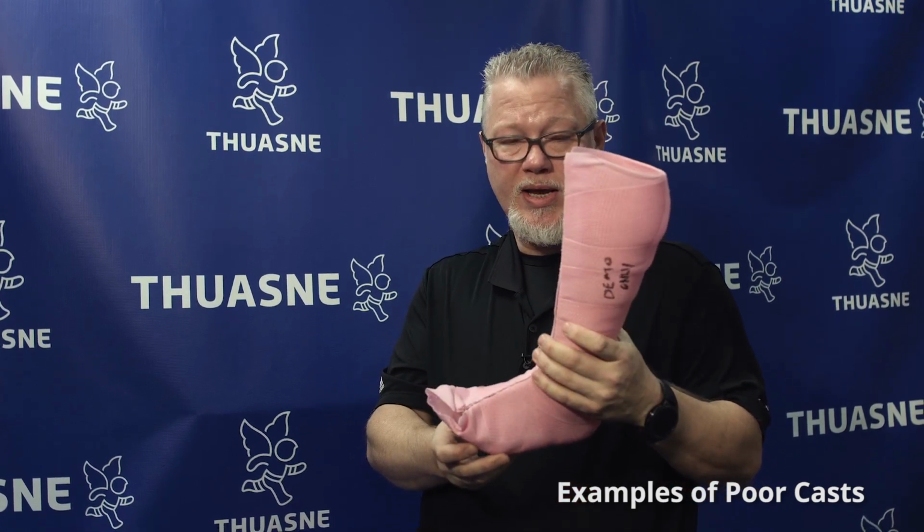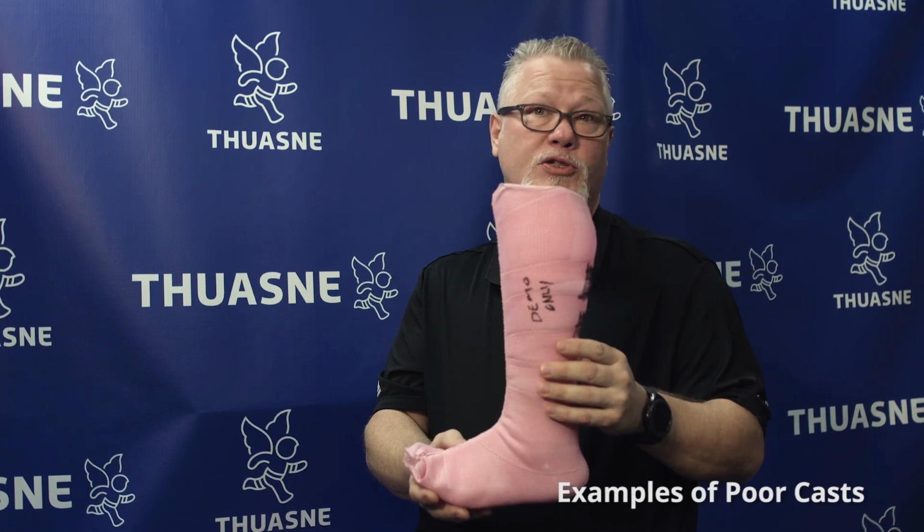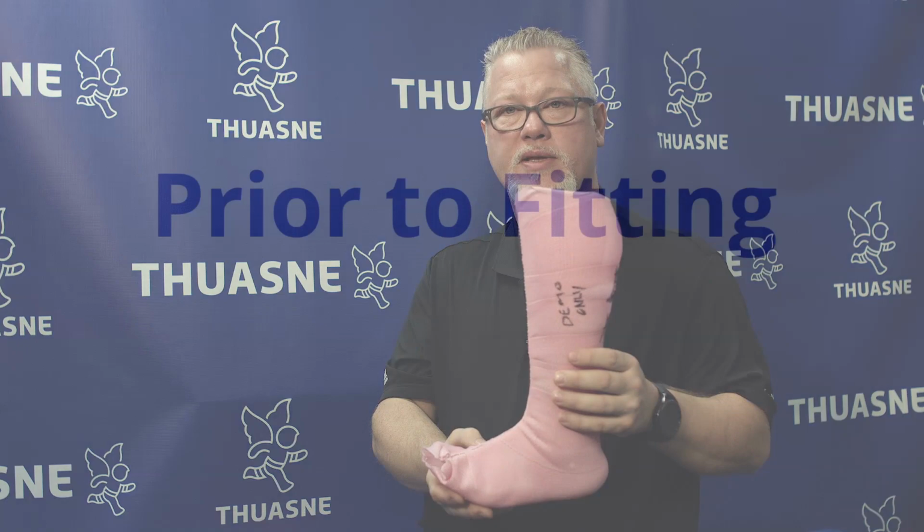So A, these casts are not symmetrical, B, in and of their own, they do not match the work order, so we would have to make a phone call on this and possibly ask for a new cast.